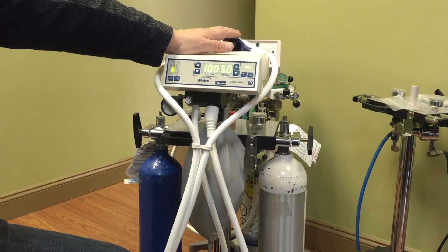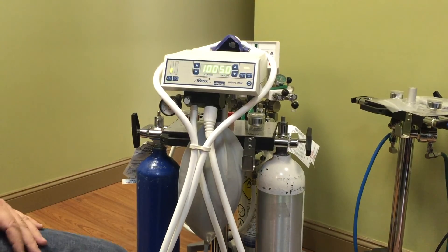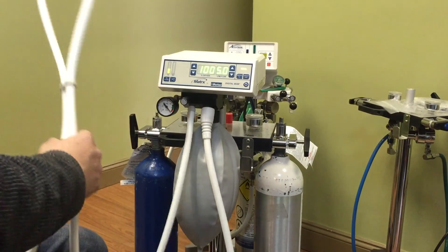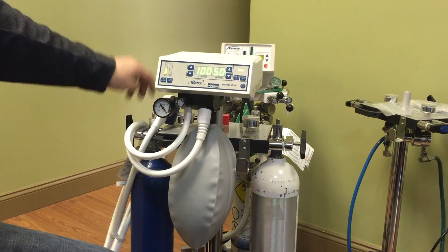We do also have these nasal hoods in disposable scented flavors. So once you set this up on your patient, your next step — I'm going to remove this so we get a better view of the unit — your next step would be to actually set your flow rate.